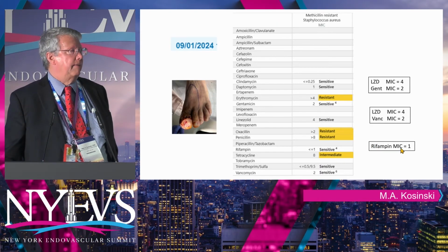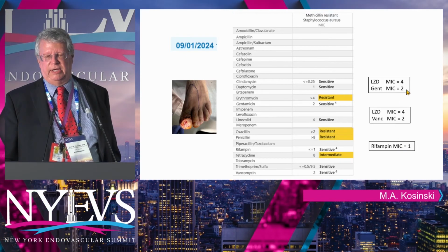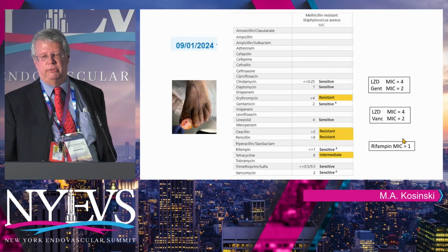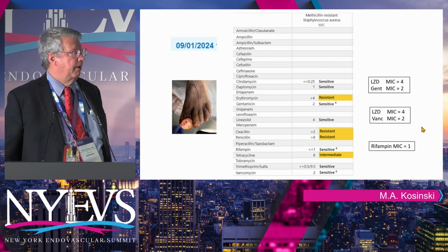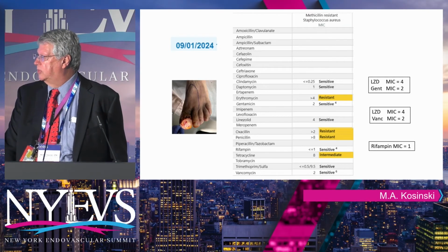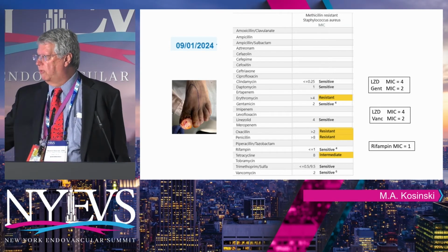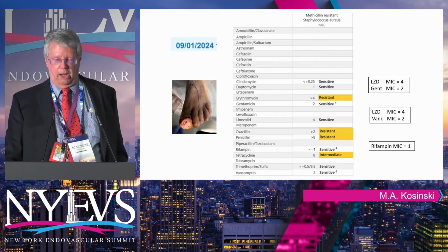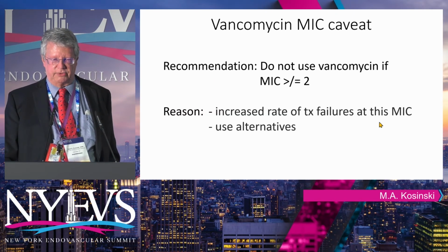Look at rifampin. Rifampin has an MIC of 1. It beats everything above here. Maybe rifampin is the best drug, and I just need to put the patient on rifampin. But we all know that putting a patient on rifampin is not something we do as single-agent therapy, because rapid resistance can develop. So you get the idea. Choose the antibiotic on its merits, not the MICs.